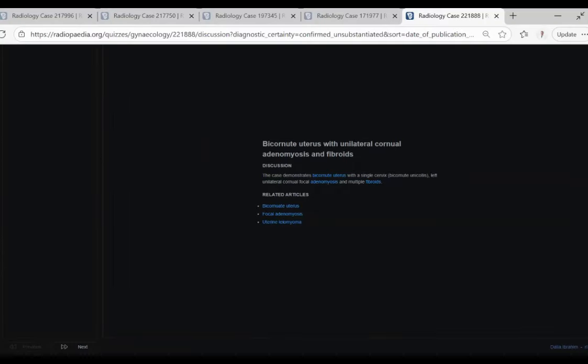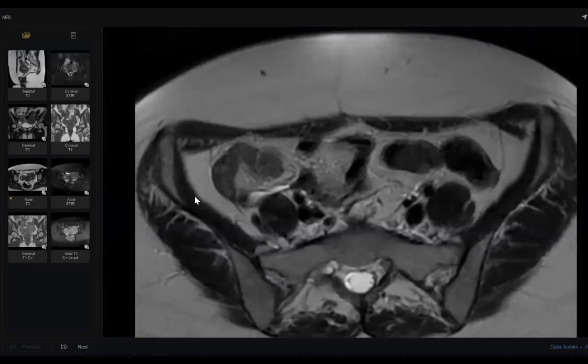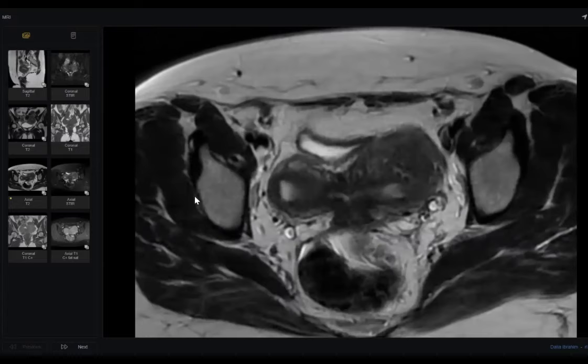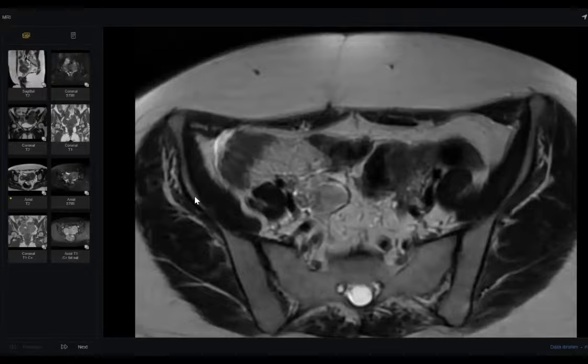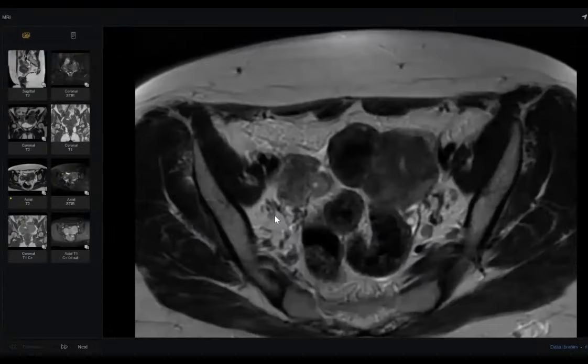Okay, thank you. We should also comment on the ovaries. In any case of adenomyosis, try to pick up any endometriosis, even ovarian. So we should look at the ovaries. How to pick up the ovaries? Follow the iliac arteries or vessels on both sides. Go down.